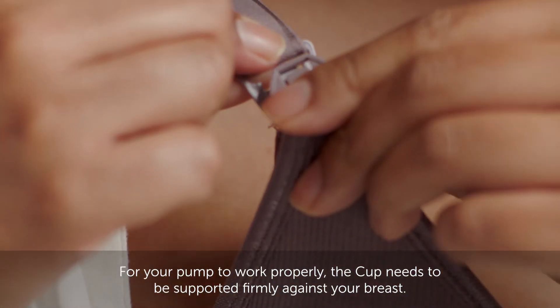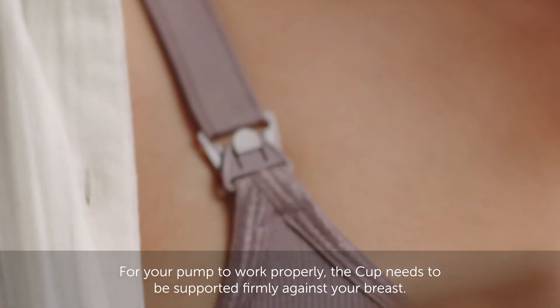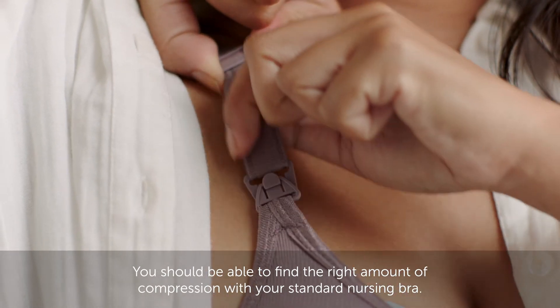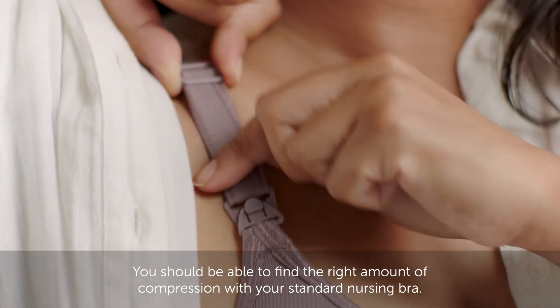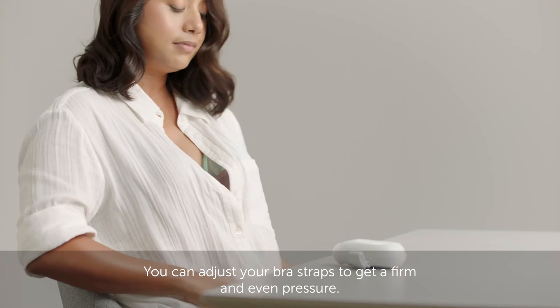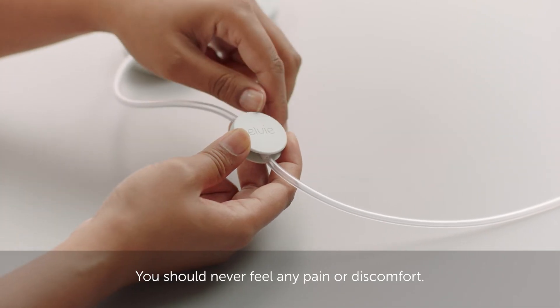For your pump to work properly, the cup needs to be supported firmly against your breast. You should be able to find the right amount of compression with your standard nursing bra. You can adjust your bra straps to get a firm and even pressure. You should never feel any pain or discomfort.